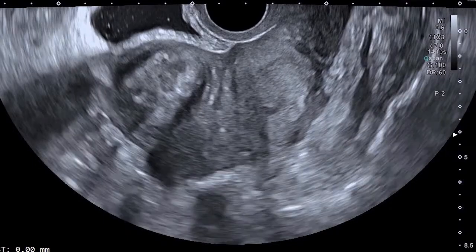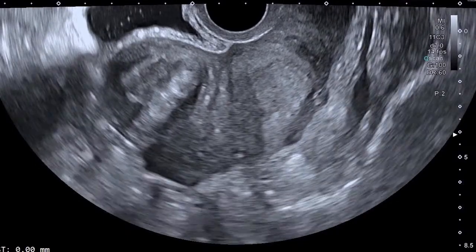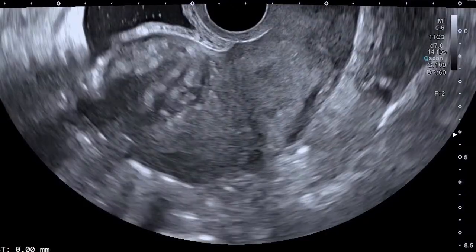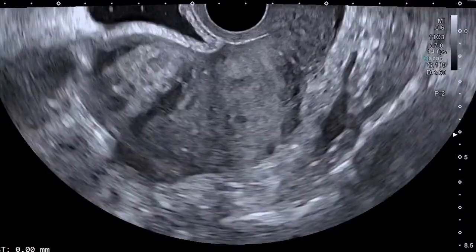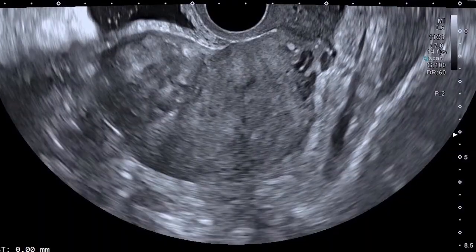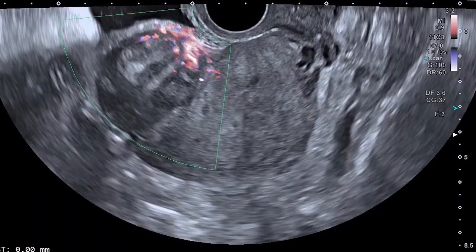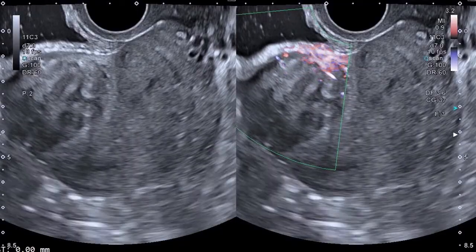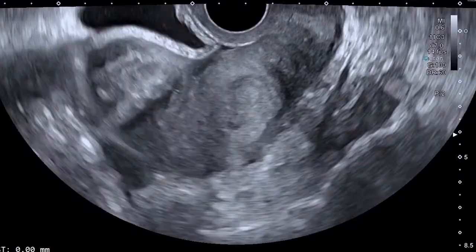That's our uterus there. You can see the blood vessels there. That's the bladder there, which is fine. So the fibroid is here. That's a well outlined fibroid there. You can see this one has microvascular flow. There's no color flow inside.